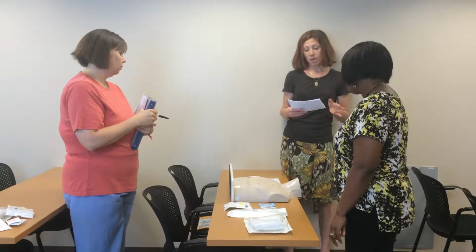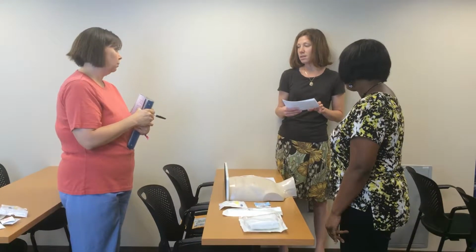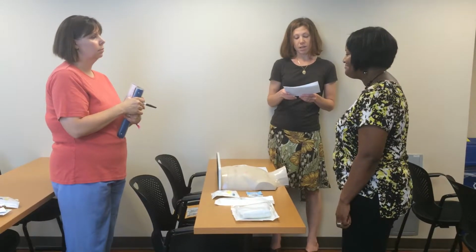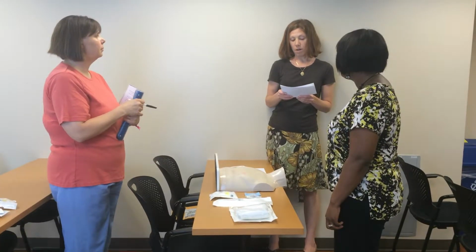As you know from reviewing the ASCO article before this simulation, proper central line care and maintenance is one of the most important things that you can do for the oncology patient to prevent infection. I'm asking that you work on Chester as if he was a real patient in a real patient scenario. I'll give each of you a checklist, and I'd like you to take turns accessing Chester's port as if you were a preceptor, discussing aloud to your colleague and the patient the steps that you are doing and why.